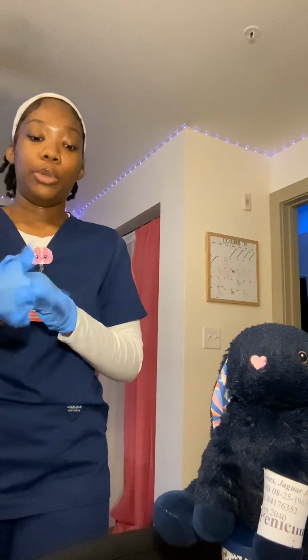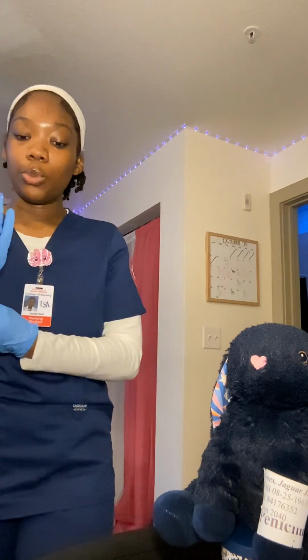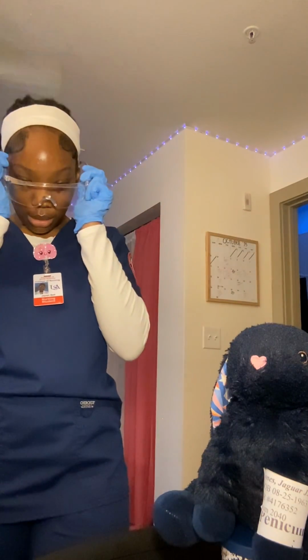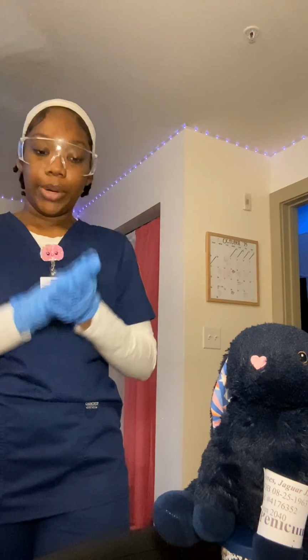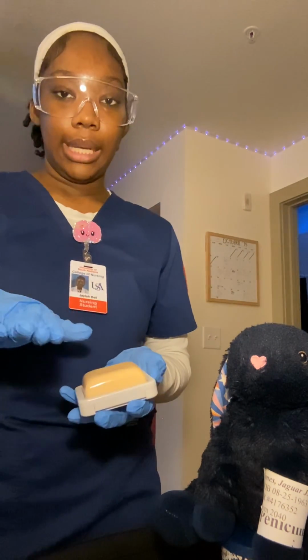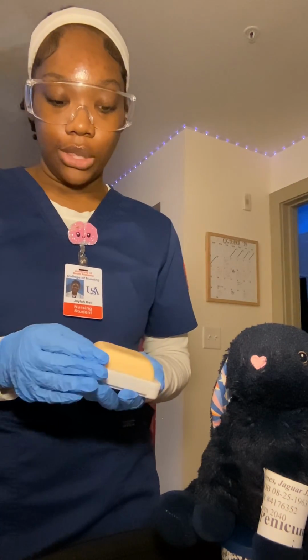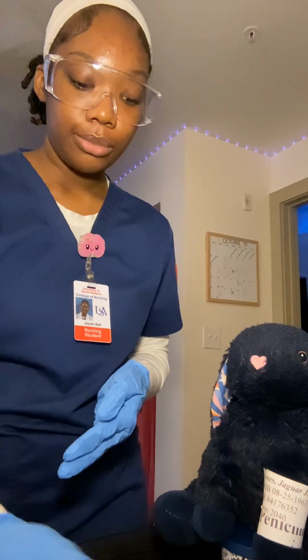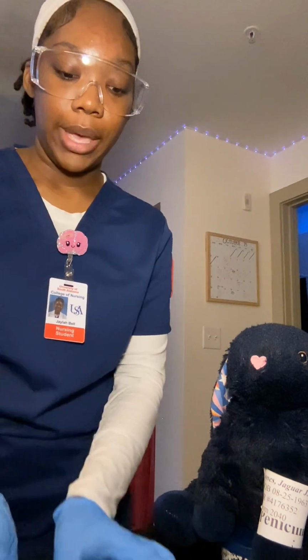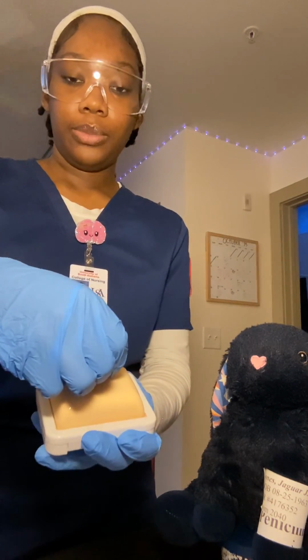Alrighty, Mr. Jones, this is going to be really fast. Just going to be a little pinch and a small poke. And I'm going to be out your way. I'm going to place my goggles on there too. Right. So before I get started, I just want to assess Mr. Jones' skin, make sure there aren't any bruises or lesions or anything. And his skin does look okay. I don't see either of those, so we're good to go. So first I'm going to clean his skin with another new alcohol pad. And I'm going to clean it from the center, moving outwards.